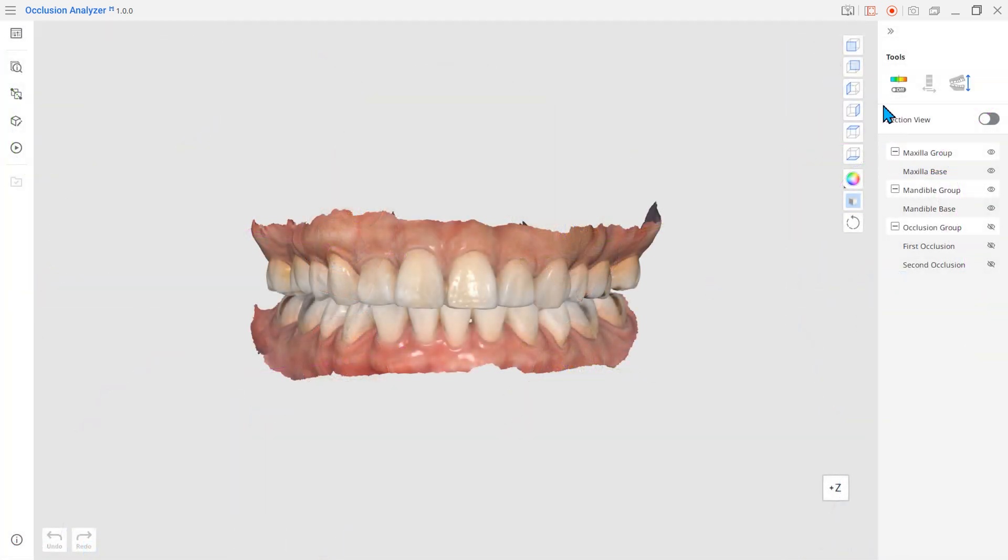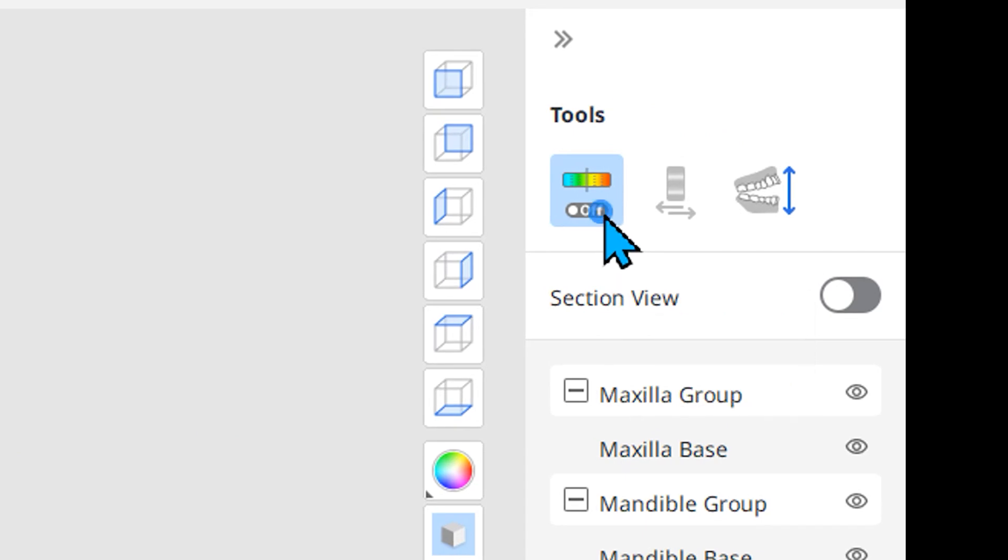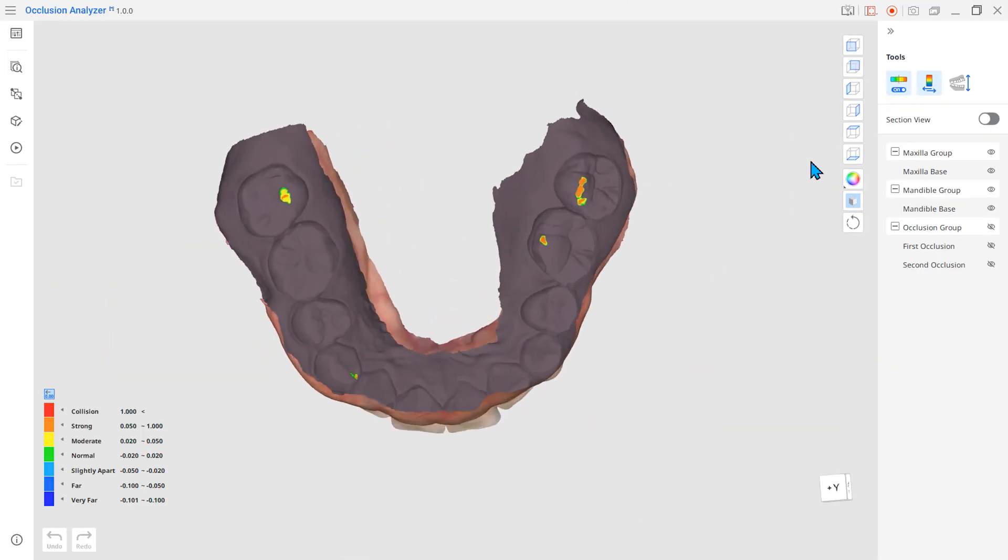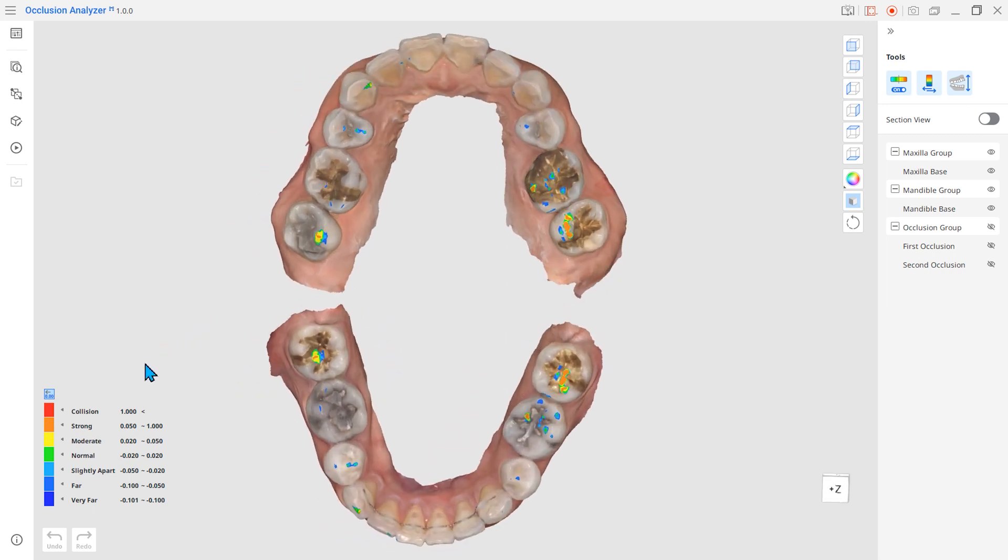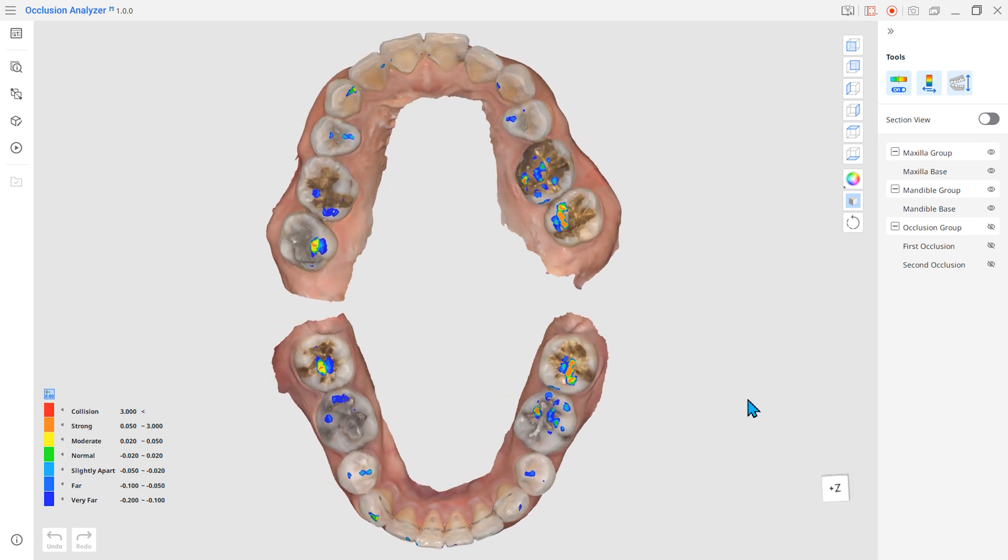We also improved our Color Map feature specifically for this app. Now it is available in both the opened and closed-jaw states. The color bars offer both text and numeric information, and if needed, you can adjust the value range manually.